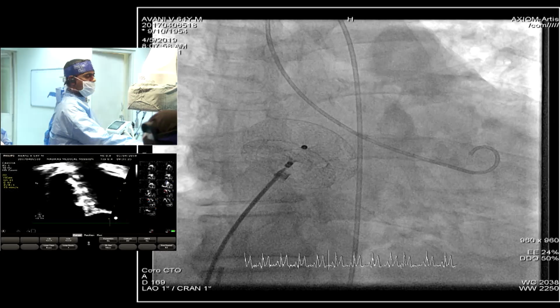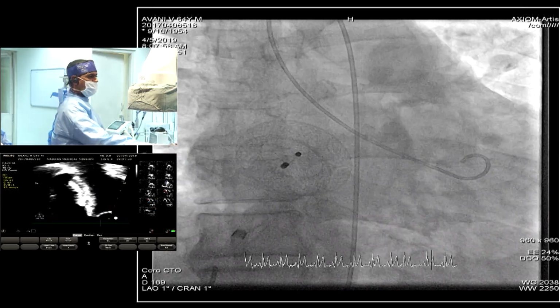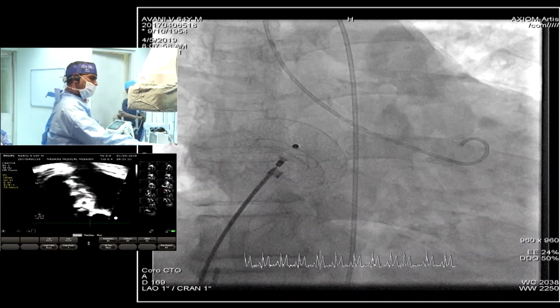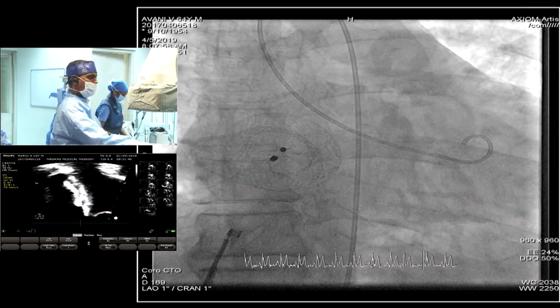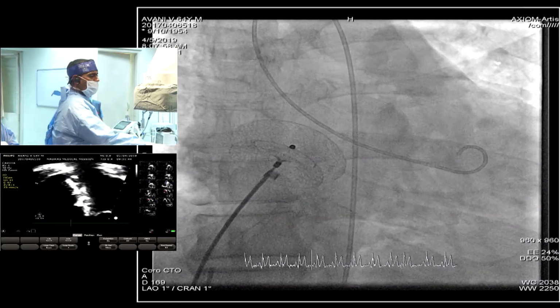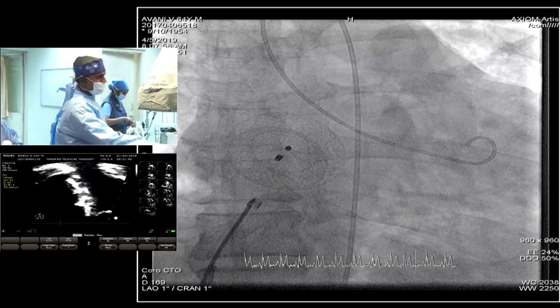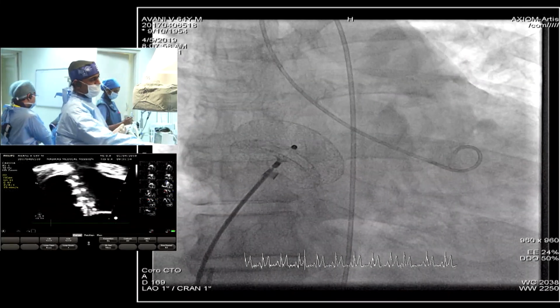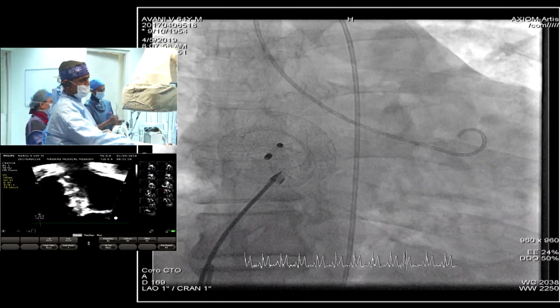Yeah, that is the protocol that we also follow in patent foramen ovale. When it comes to atrial septal defect, usually we don't do this bubble test at all. So in patients who have a previous positive bubble test and a PFO with a documented previous stroke, or for some rare cases of migraine that we might close, we always do a bubble test before we stop the aspirin. And even the duration of aspirin in those patients with a previous history of a stroke will go on. I sometimes even leave it for 1 year, 1.5 years. I don't stop it strictly at the end of 6 months.